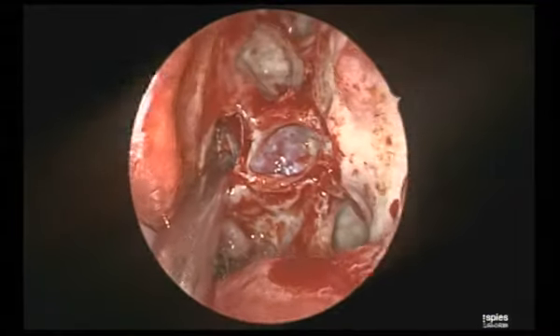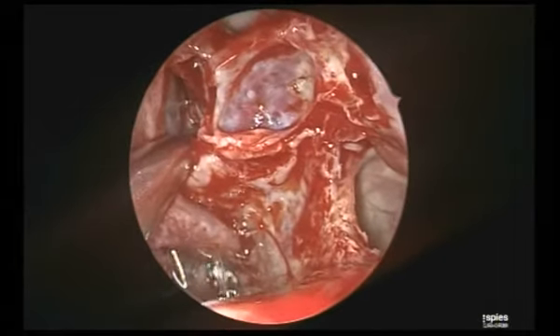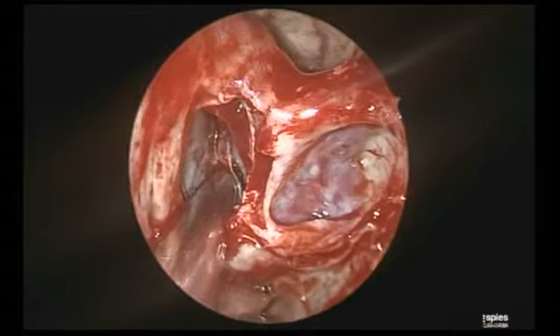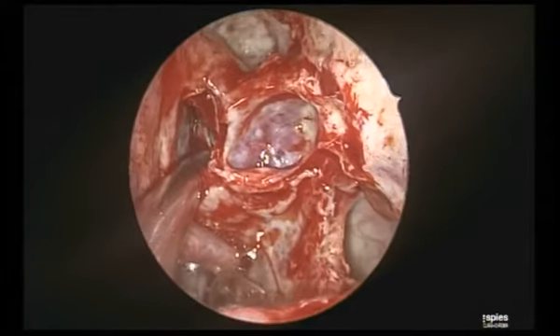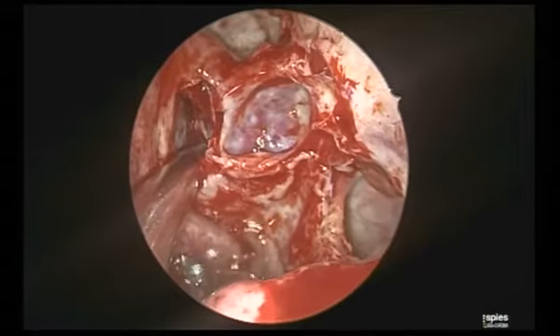See, now I am withdrawing my scope and seeing what? See, the maxillary line. At the level of the sphenoidal recess, staying close to the septum, not going above the maxillary line. That's the important horizontal line. My message to the juniors is not going above the maxillary line.